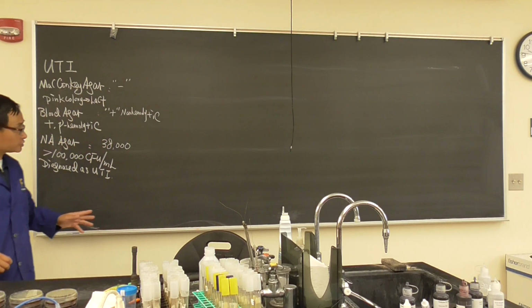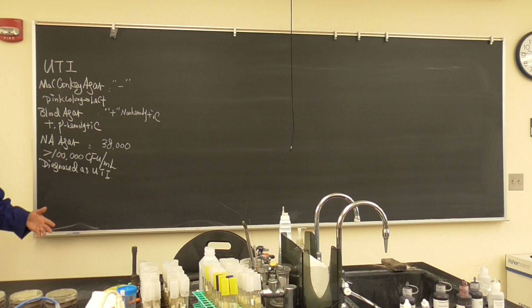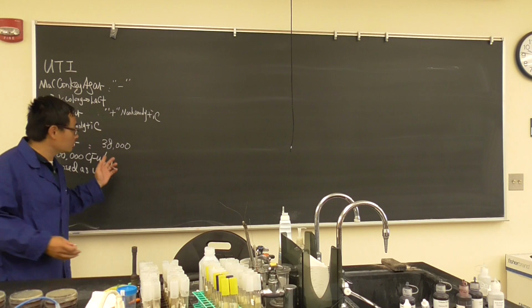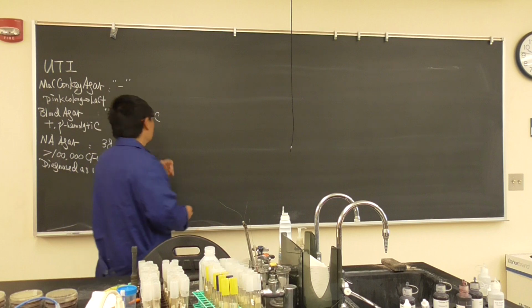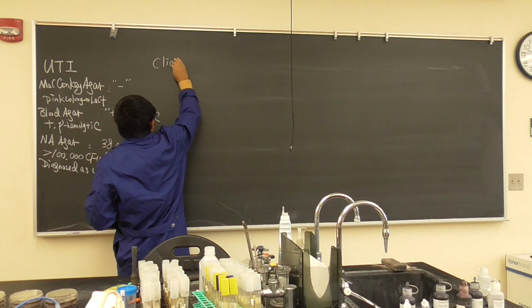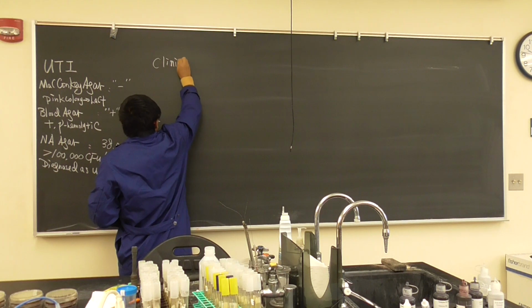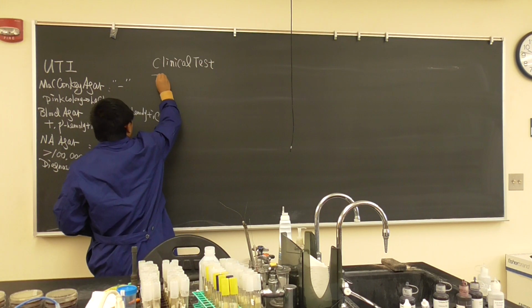So this is our first urinary tract infection, simulated nurse and patients. We talked about this. So today we're going to do a second clinical testing. It will be throat culture.